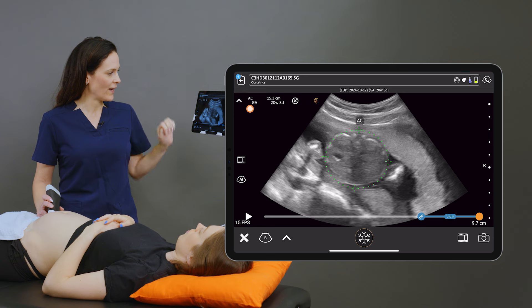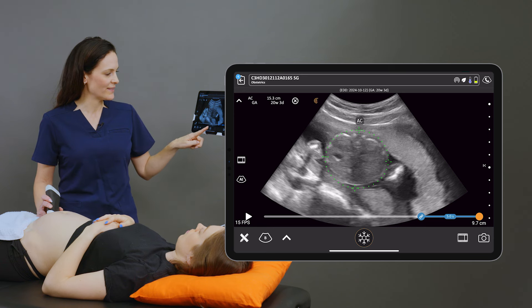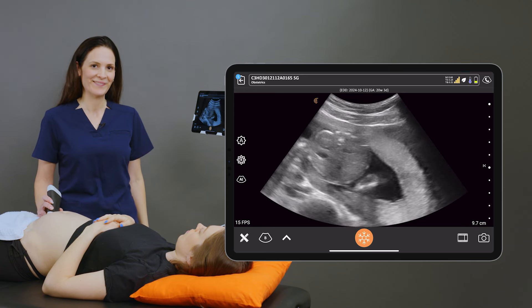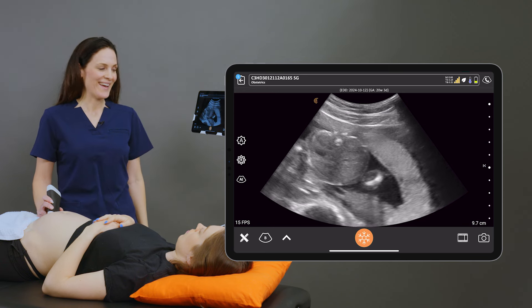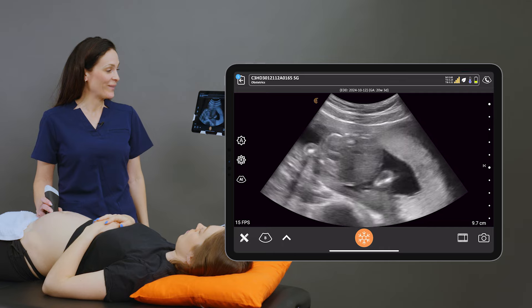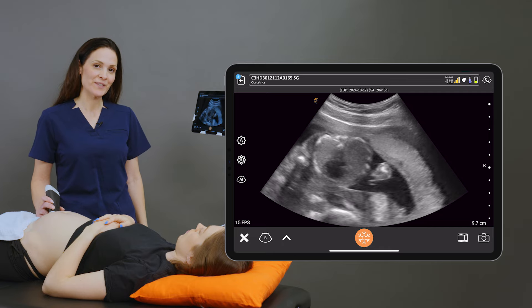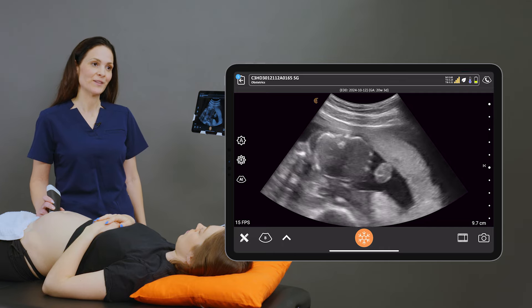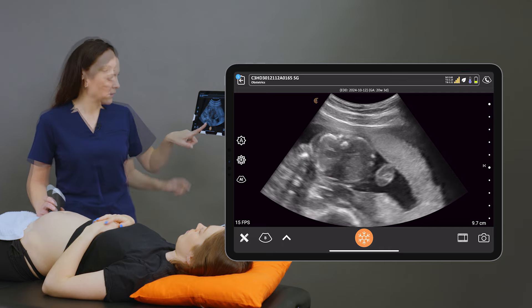At 20 weeks and three days, we can save that image, and that's how we can easily measure an abdominal circumference on a second trimester pregnancy.